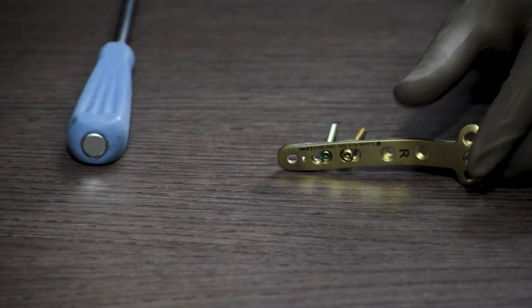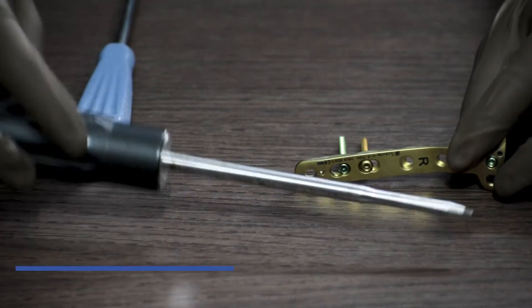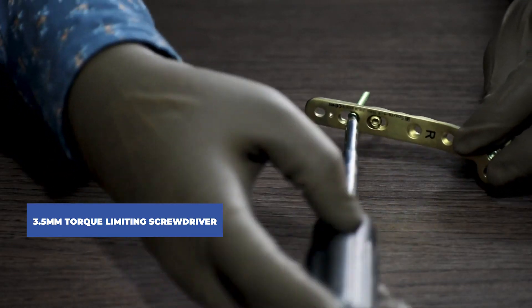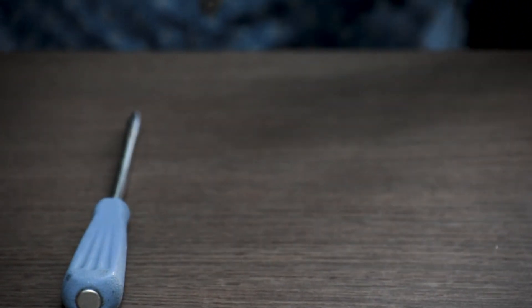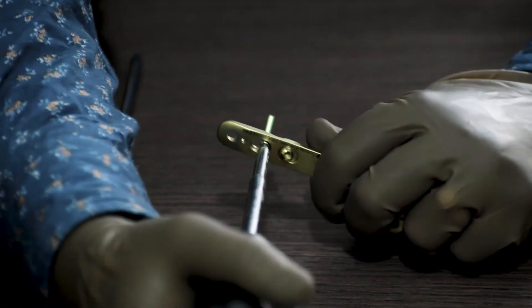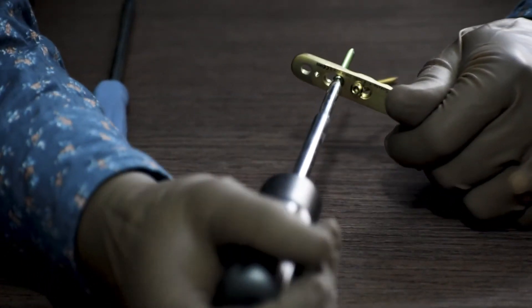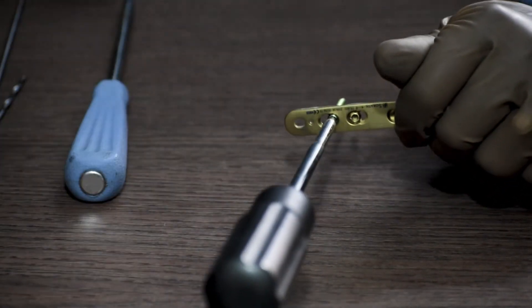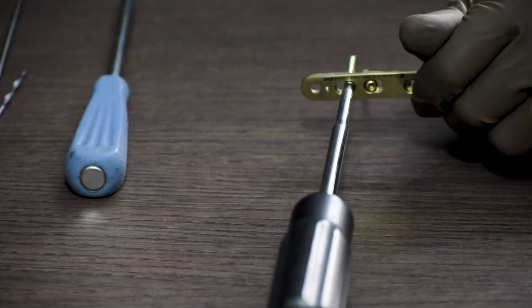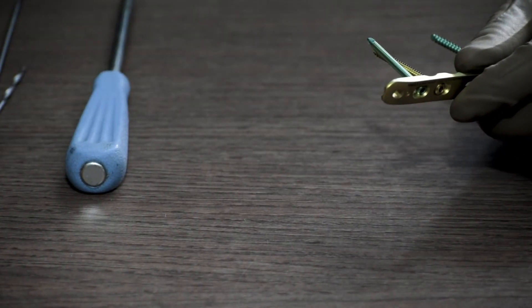Once this is done, for a final check on the locking screws, we use a 3.5mm torque limiting screwdriver for the 3.5mm system, or a 4.5mm torque limiting screwdriver for the 4.5mm system. We keep tightening the locking screw until it makes a click sound, after which we do not tighten it any further. The click sound means the screw is completely locked.